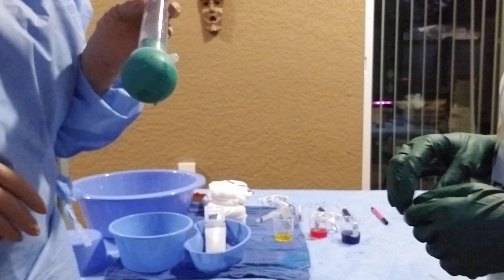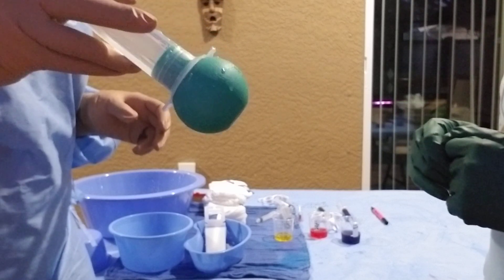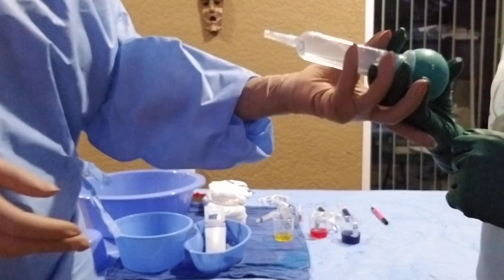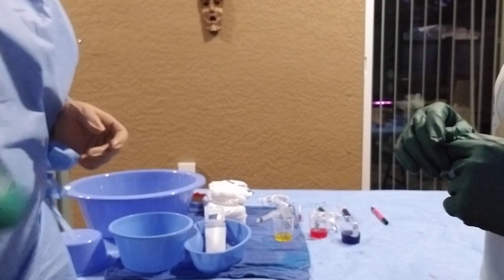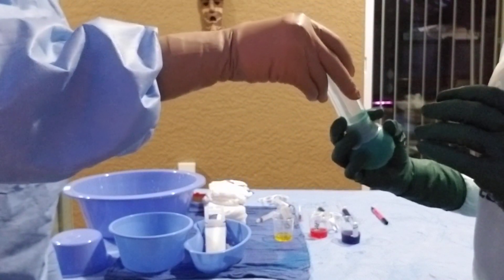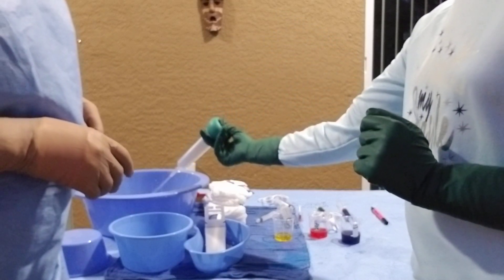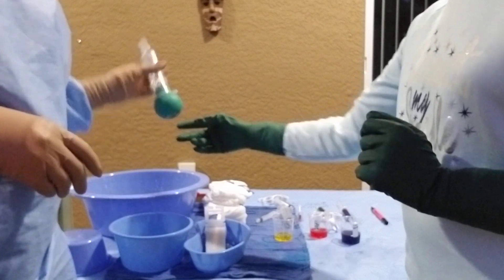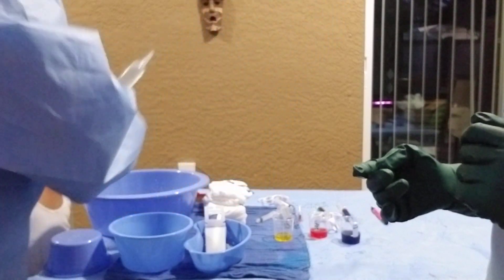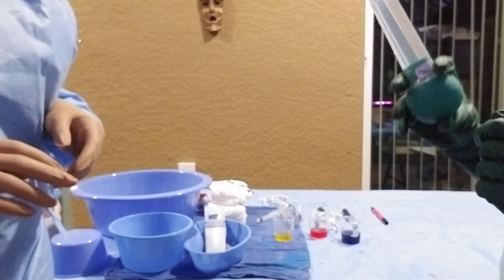When passing the asepto, if you hold it by the bulb it's going to leak. So when you pass it, hold it at the top and put the bulb into their hand so they can easily start squirting. Make sure they have it firmly, then let go and they'll use it. When they hand it back empty, you grab it, squeeze, put it into your saline to fill it up, and hand it back. Then they'll use it again.